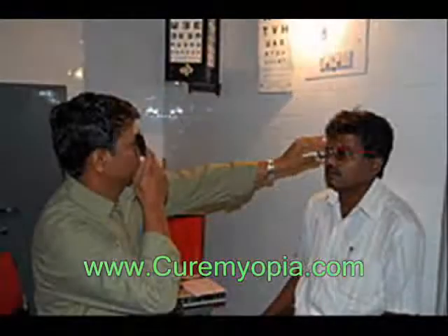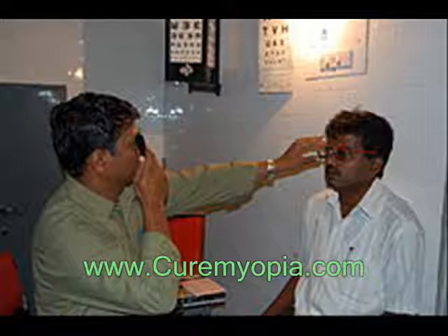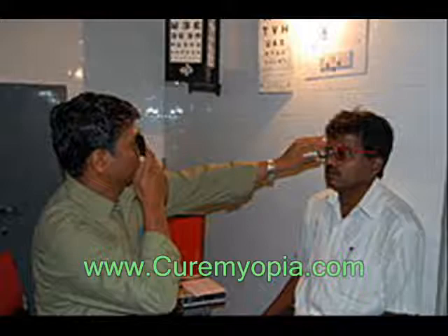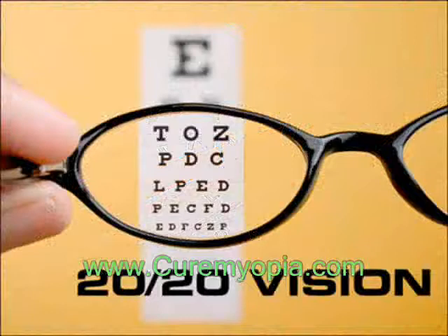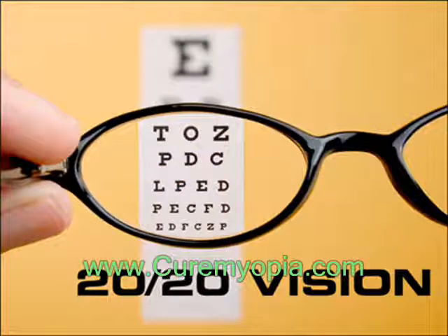For people over age 40 who have normal distance vision but difficulty with near vision, a refraction test can determine the right power of reading glasses. If your uncorrected vision is normal, then refractive error is zero and your vision should be 20/20. A value of 20/20 is perfect vision, meaning you are able to read three-eighths inch letters at 20 feet.